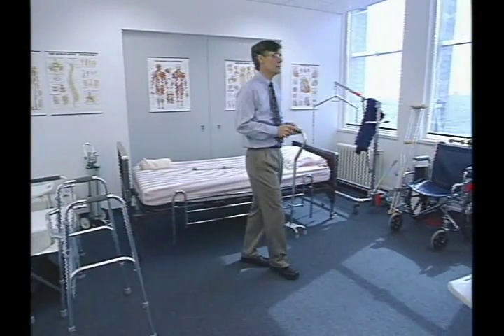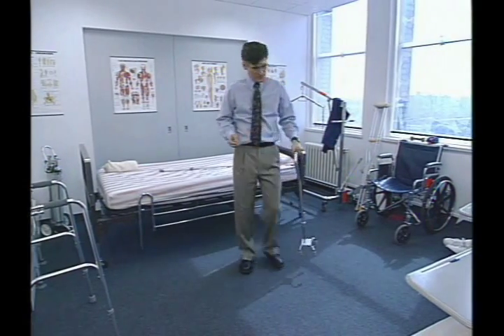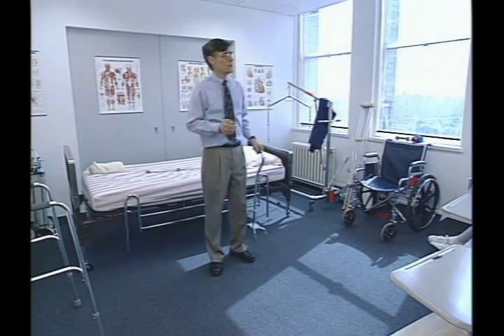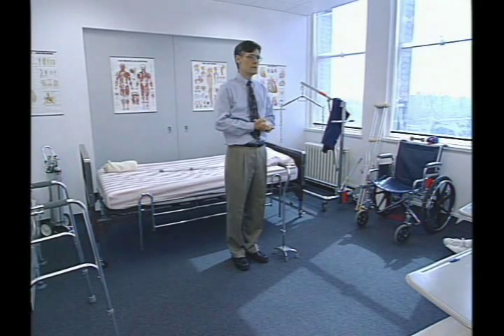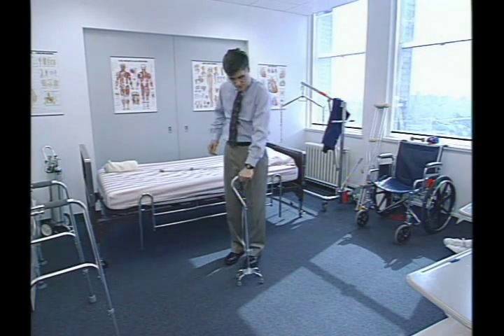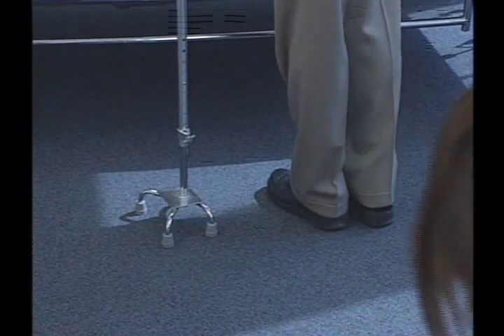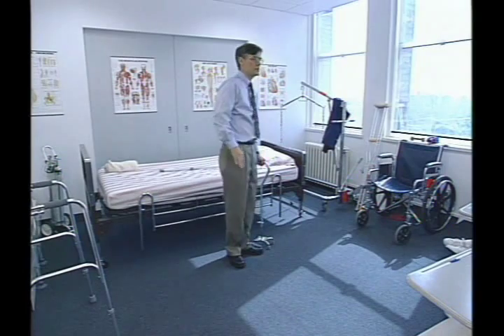The turning technique with this cane is also important, just like it is with the walker. You don't want the person to just hold the cane and turn around without getting support. For the correct turning technique, think of a circle going around your body. Then we put the cane on the circle, step, step; cane on the circle, step, step; cane, step, step. Going the opposite way: cane on the circle, step, step; cane, step, step; cane, step, step.